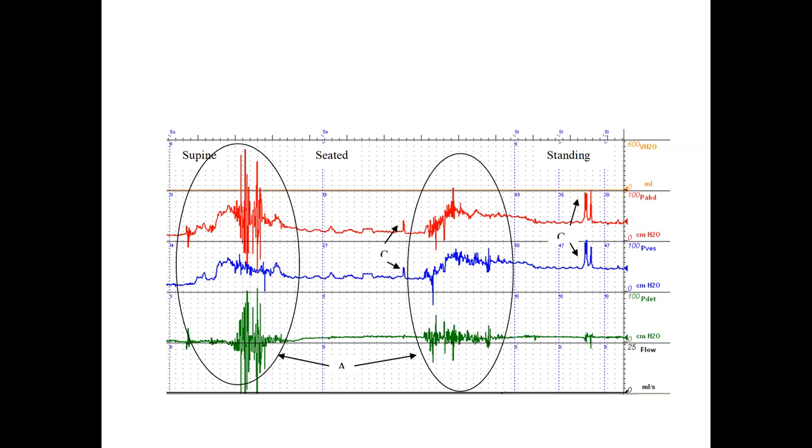Now, again, I'm not asking you to do anything about them. I'm asking you to be aware of what they are. What I am suggesting might be useful is that between each movement of your patient, so into different positions, you perform some form of quality check. So in this case, a cough test, just to make sure that lines haven't become dislodged at any point during the test, or that you haven't trapped them under something in the process of moving this patient.